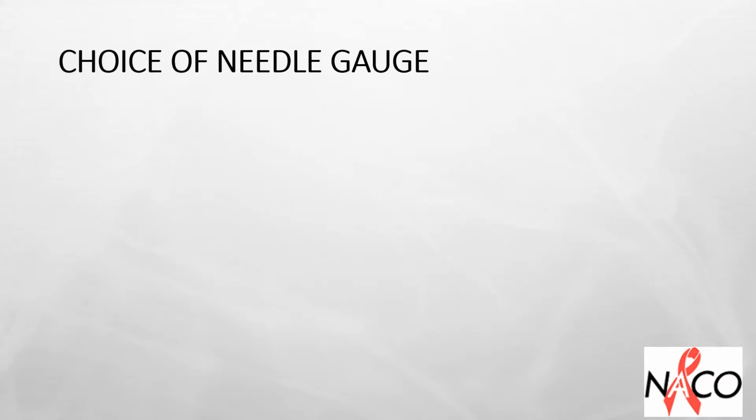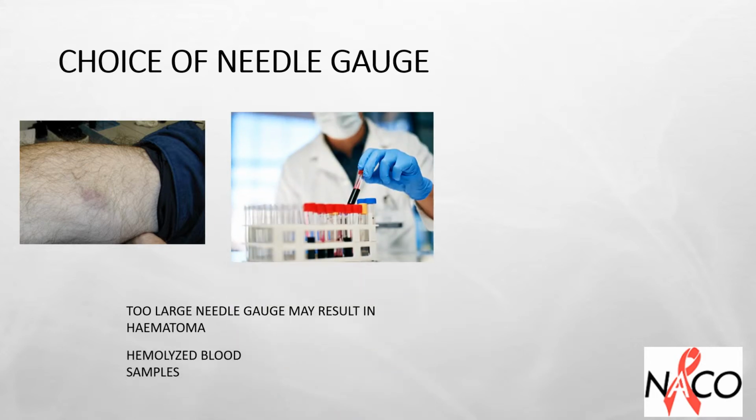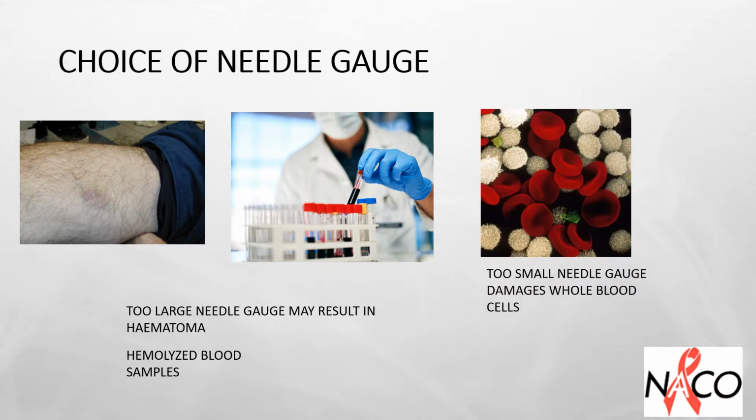Choice of gauge for needles. If the needle is too large for the vein for which it is intended, it will tear the vein and cause bleeding or hematoma. If the needle is too large, blood enters the tube faster and forcefully and may result in hemolysis. If the needle is too small, it will damage the blood cells during sampling, and lab tests that require whole blood cells and tests such as potassium, bilirubin, LDH, etc., that get affected due to hemolysis will be invalid.